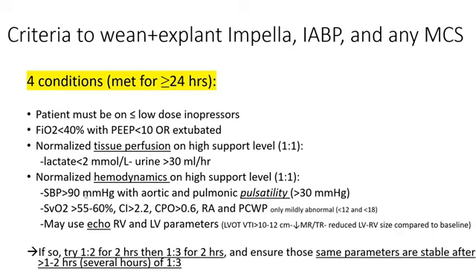Your systolic blood pressure is over 90, or your mean pressure is over 65, and you're starting to have aortic pulsatility over 30 millimeters of mercury, including on the assisted aortic pressure. And you need to have those SWAN measures, PA-SAT over 55%, index over 2.2, cardiac power output over 0.6, and especially, the most commonly used are those, RA and wedge pressure, only mildly abnormal. Some use echo parameters, those are not commonly used, like shrinking LV and RV size, improving LVOT VTI, which corresponds to cardiac output.